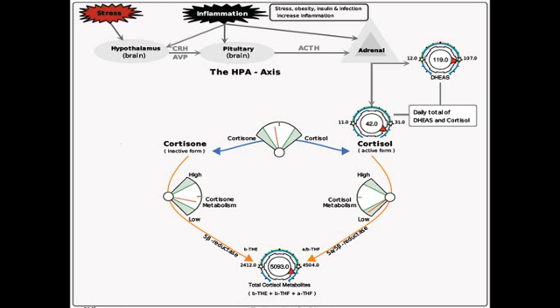So what we want to look at is what happens when cortisol is increased. When we have an acute stressor, of course cortisol is going to increase, and if cortisol increases and we have healthy metabolism, then we're also going to get increased levels of total cortisol metabolites as well as DHEAS. And this is not necessarily unhealthy. When you're stressed, these levels go up, and then when the stressor is gone, the levels are going to return to baseline, and that's normal, healthy function.